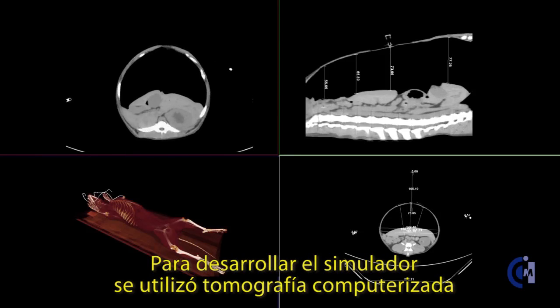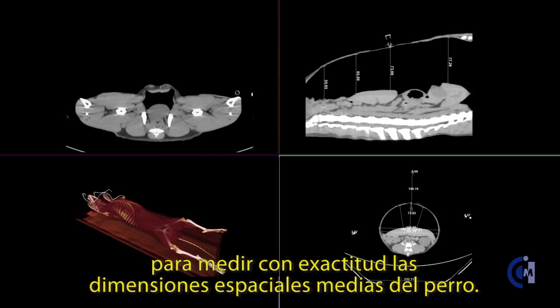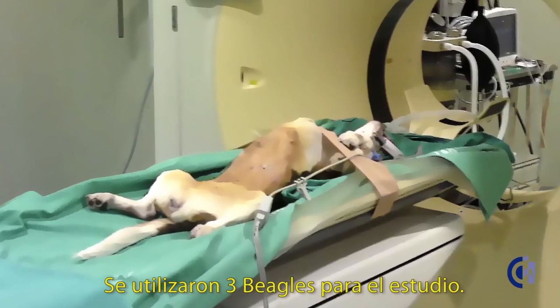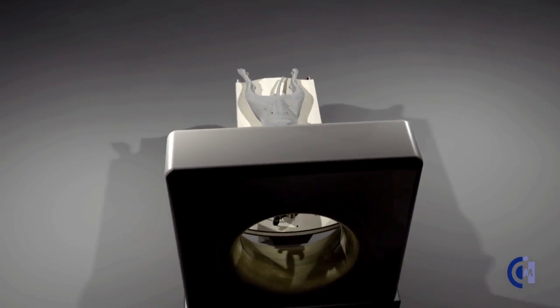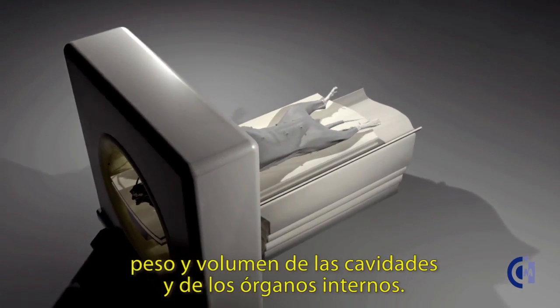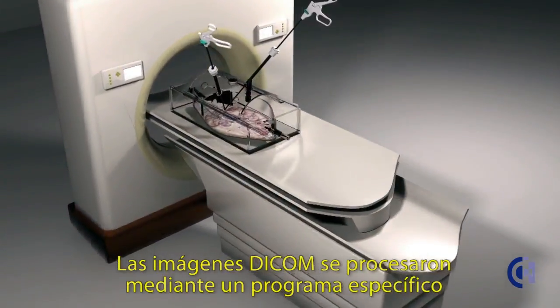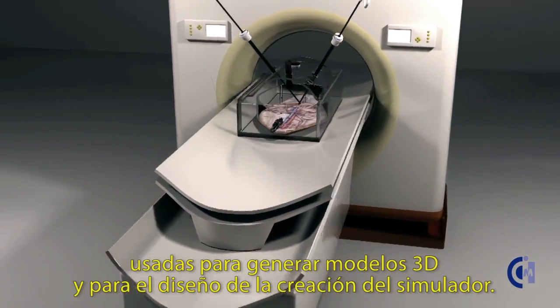To develop the simulator, we started by using computed tomography to reliably measure the average spatial dimensions of the canine species. Three beagles were used for the computed tomography study. Exact data of abdominal and thoracic perimeter, height, and volume of the cavities and their internal organs were obtained. DICOM data was processed by specific software and used to generate 3D models and a design for the creation of the simulator.